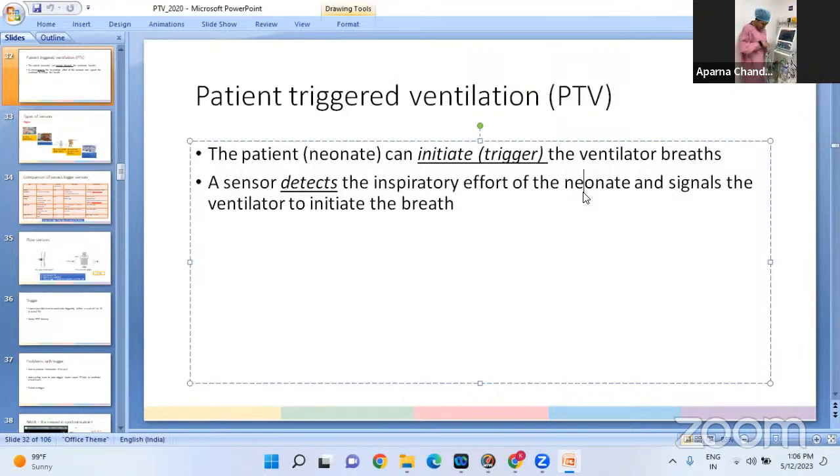Through this inspiratory and expiratory tubing, there is always a constant flow of gas which is fixed as per the ventilator make. So for this SLE 6000 ventilator, there is a bias flow of gas which we cannot change. Whereas in a Draeger ventilator or Babylog ventilator, we can actually change the flow based on the baby's weight or size, like we discussed, 5 times minute ventilation plus 2. But here it's going to be a fixed flow. So this flow is going to flow through the inspiratory tubing and across the patient interface and back via the expiratory tubing to the ventilator.